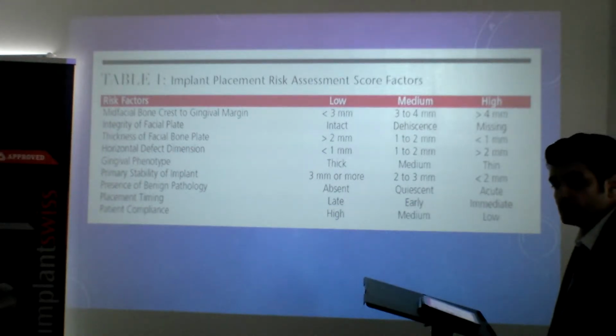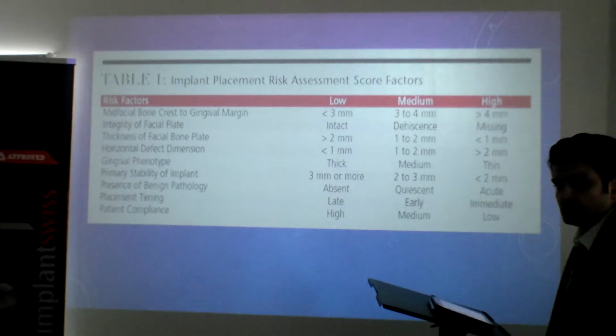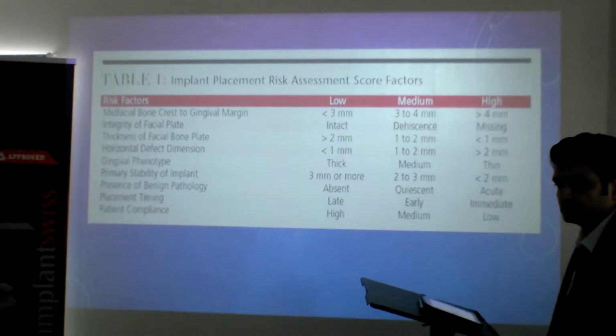Okay, there are a few different versions that you can use. Digital calipers are readily available. Use them. Specialized calipers can be used if you want, but you would possibly have to numb the patient. It's quite helpful. But yeah, 1.5 to 2 mm is what you're looking at, and that again is the initial assessment stage before the CBCT. Okay?